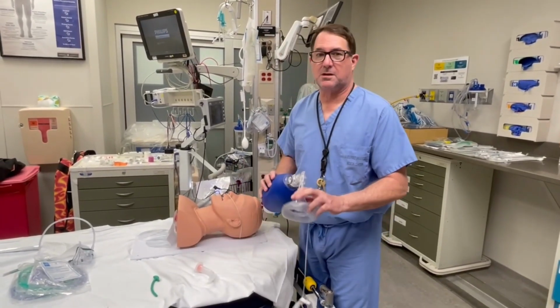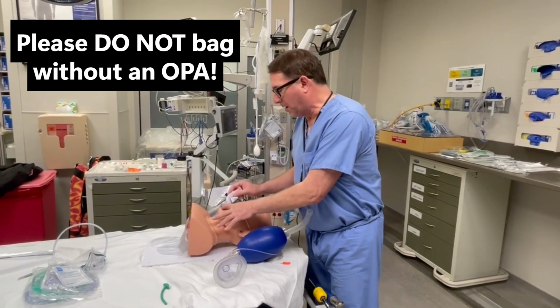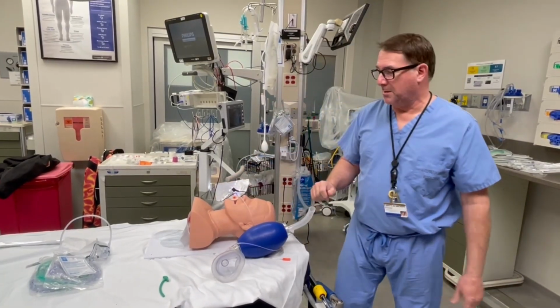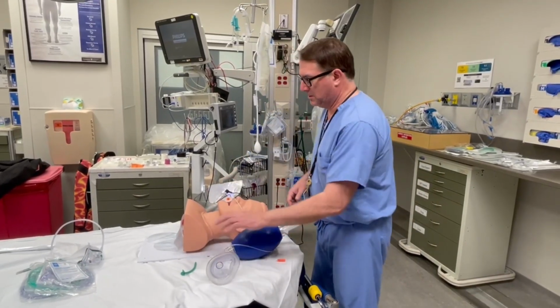So before this goes in, before you do this, you need to do this. I won't bother telling you how to put an oral airway in, but oral airway at a minimum. If you're having problems bagging the patient, you're going to add an NPA. You put the NPA in too.